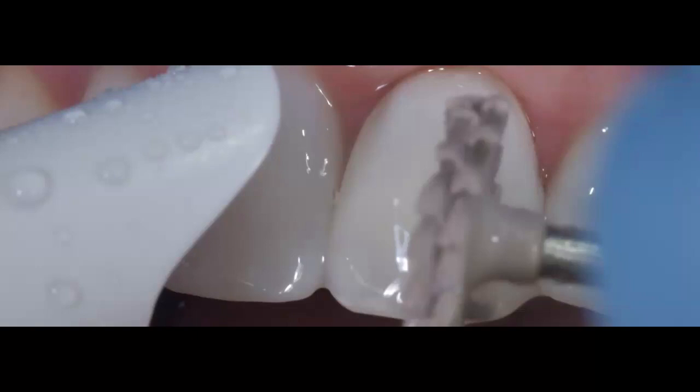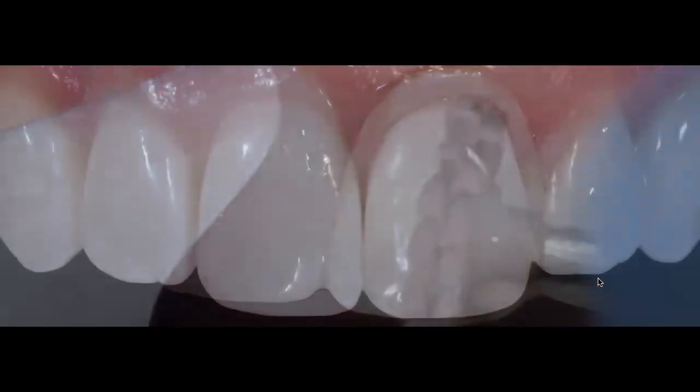Now, the luster is going to be based on how much shininess the patient has in their neighboring natural teeth, and that's really what's going to make you accomplish either an extremely high shine or just a medium or moderate high shine, which is normally the case for many of our patients.